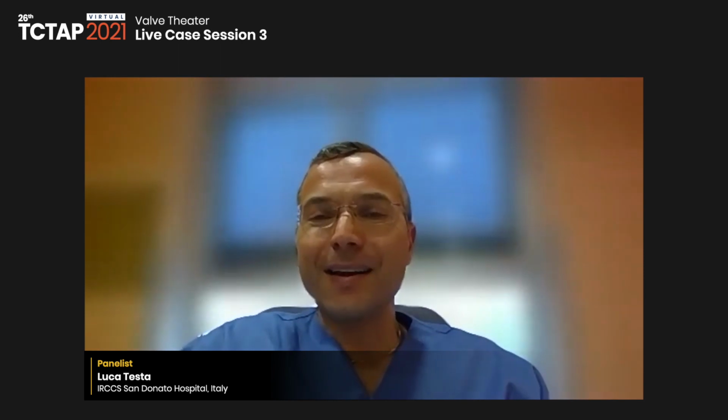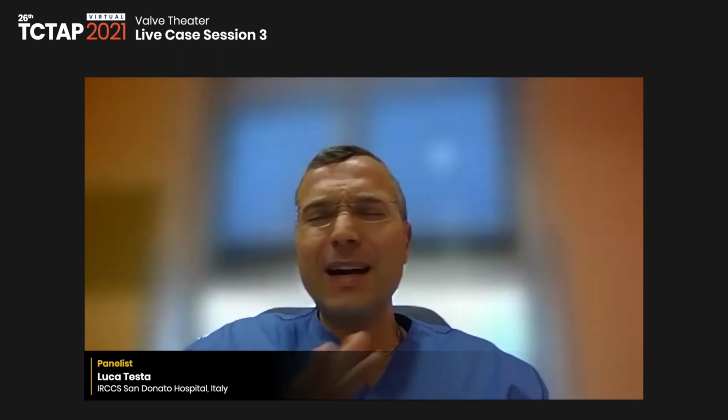But once you have good femoral approaches, good femoral iliac arteries, and good anatomy, with some calcification but not huge calcification, and you don't have bicuspid anatomy, this is really a case where you can maximize the benefit of TAVR, because regardless of the specific device you're using, you can achieve a very good result.